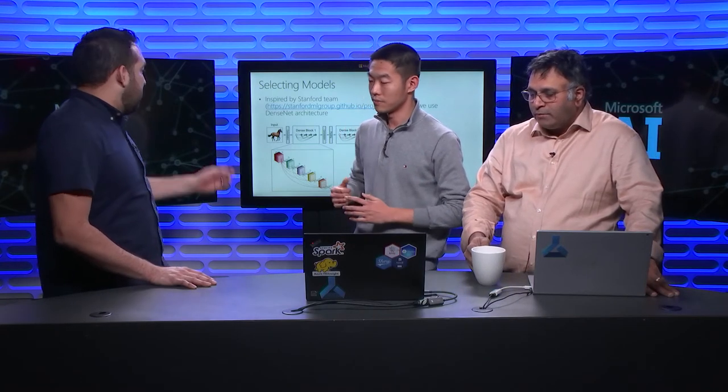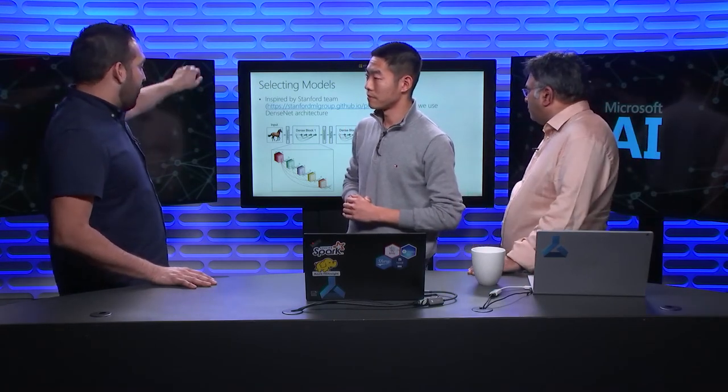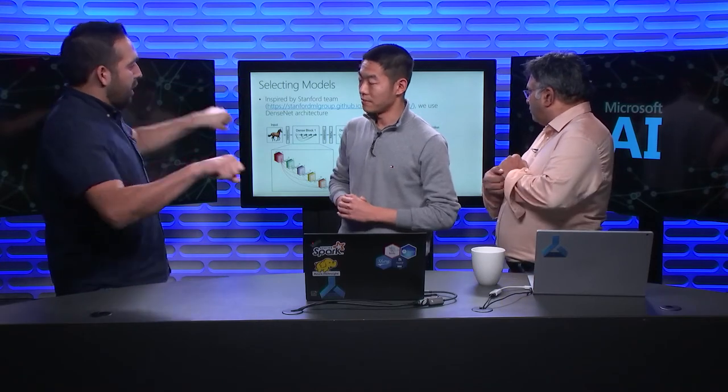This is cool. Okay, so I'm looking at the picture below, and I'm getting this notion of convolutional neural networks too, because you're boxing things like that. That's not what that's saying, right? You're right. Okay, so it's just literally like, here's some neural networks, we're gonna pass things back and forth, and we're gonna stack them on top of each other. Yes, exactly. Fantastic. And you decided to use this because you felt like you needed a deep network. How do you know which model to use?